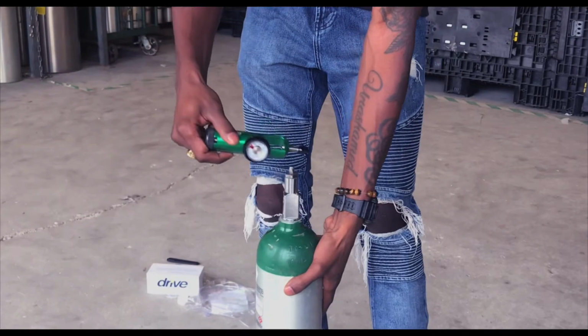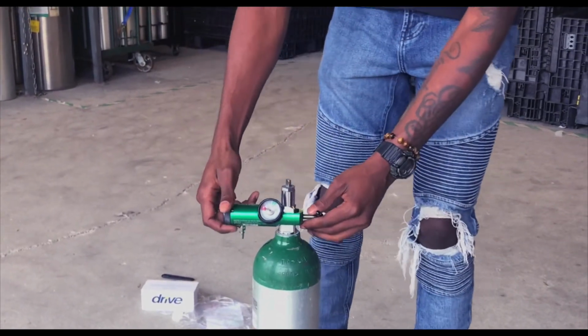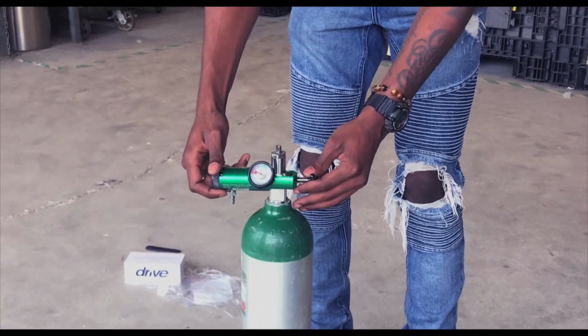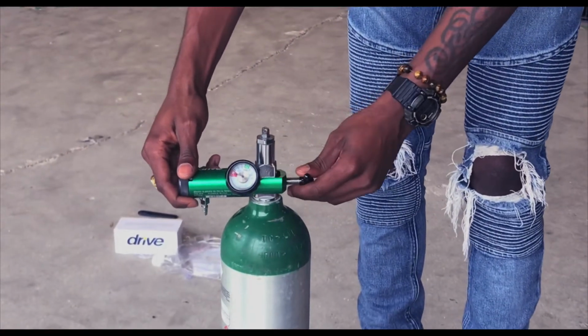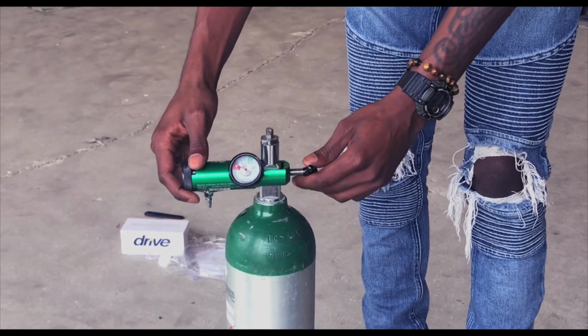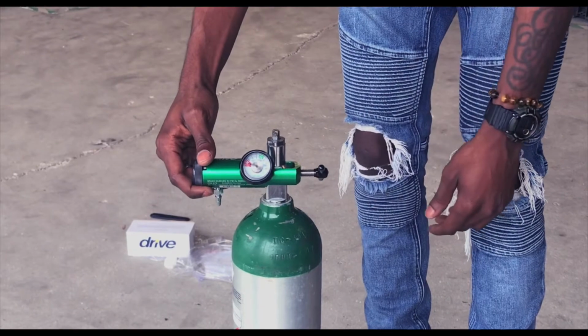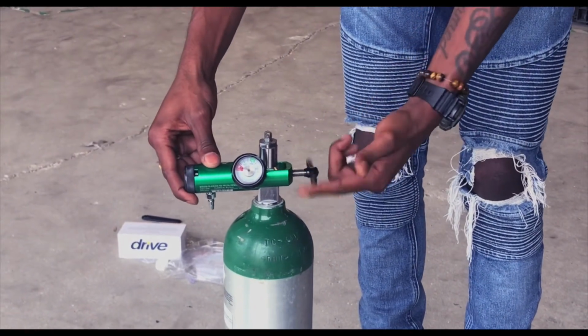So I'm going to slide it over, and I'm just going to work it so that I feel it go in. So what I tell my patients all the time is if you don't feel it go in, 9 times out of 10, it's not in right. So I'm just going to wiggle it around, and I found it. I found where it goes in, and I'm going to tighten it.